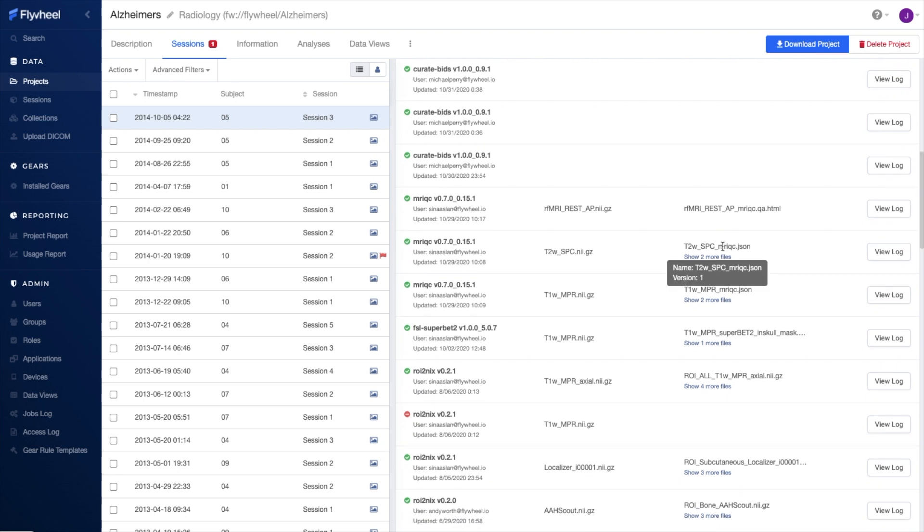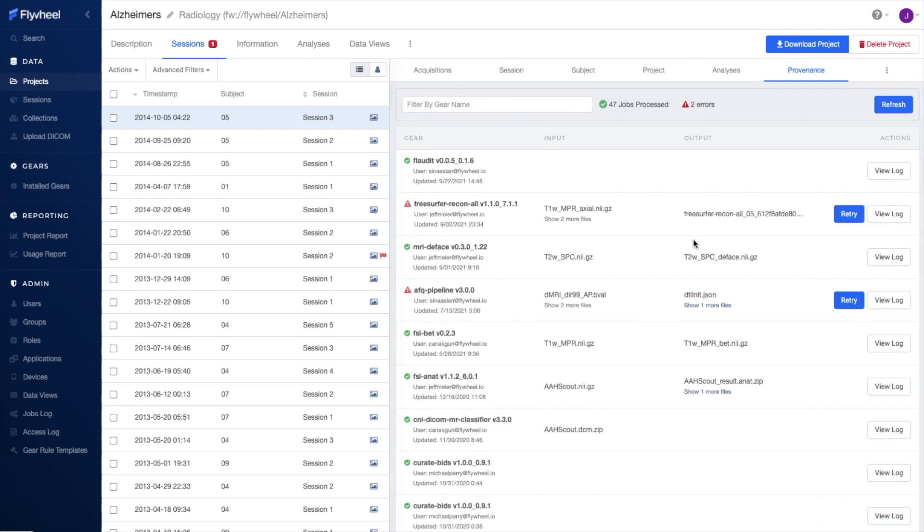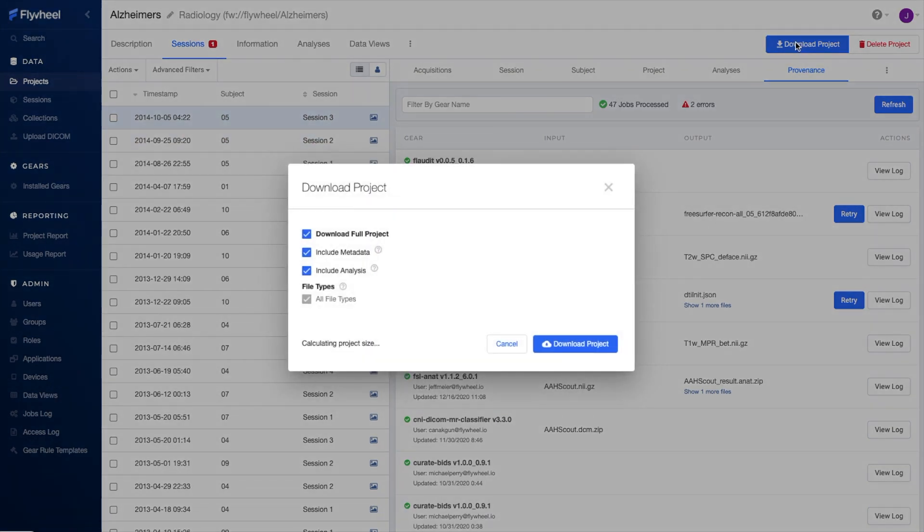Our SDKs and OpenREST APIs allow you to integrate Flywheel with your existing tools and workflows. Here in the UI, if you choose, you can easily download your entire project, including metadata and analyses.